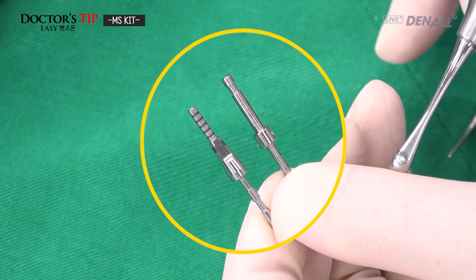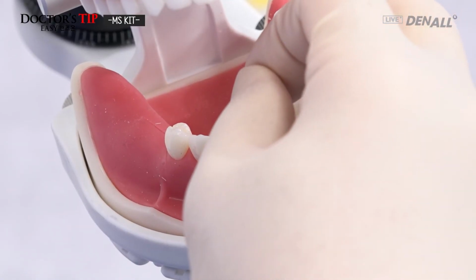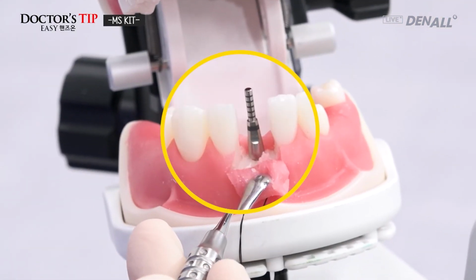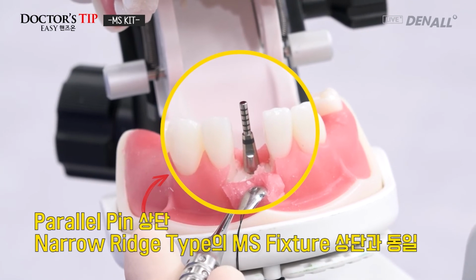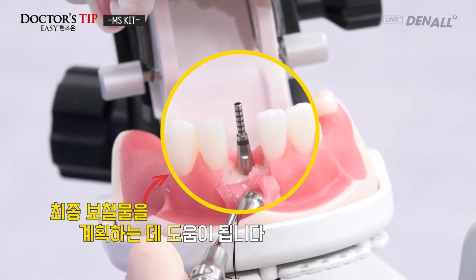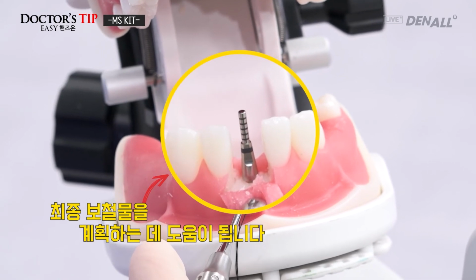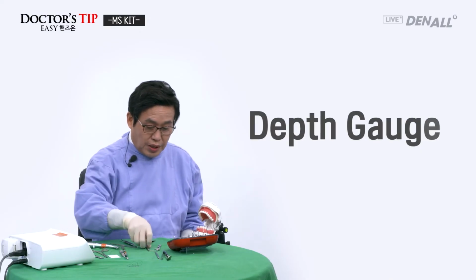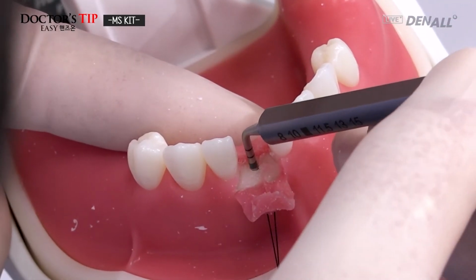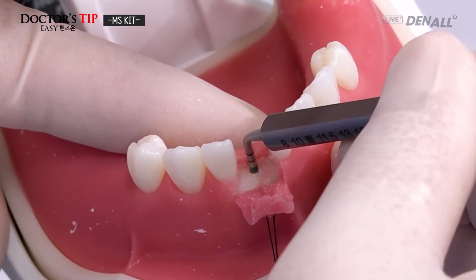So checking the final prosthesis, it's helpful because it looks the same as the implant. So you push in the guide pin, and like this, the upper part, narrow ridge type MS fixture. The design is the same as I told you, so it's helpful in planning your final prosthesis. So it's a better guide pin for doing that. Again, I'll check the depth with the depth gauge. And as you can see, it's sufficient, drilled up to 11.5 millimeters.